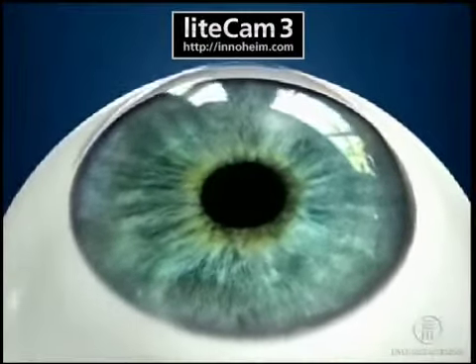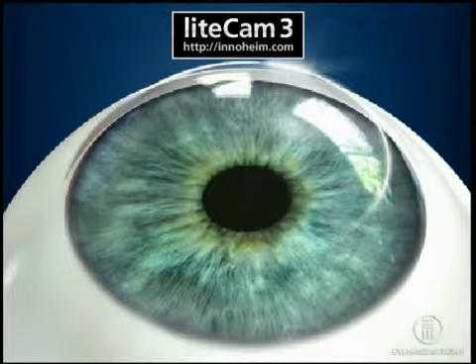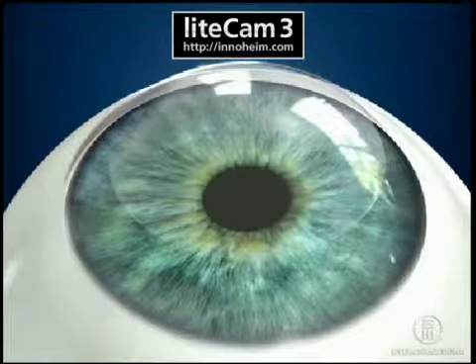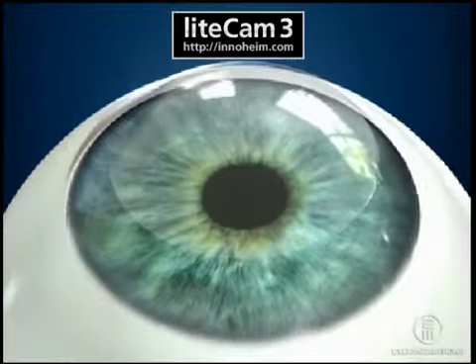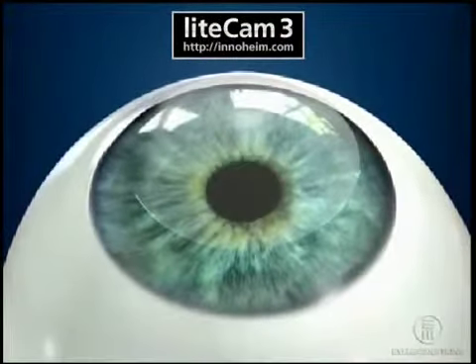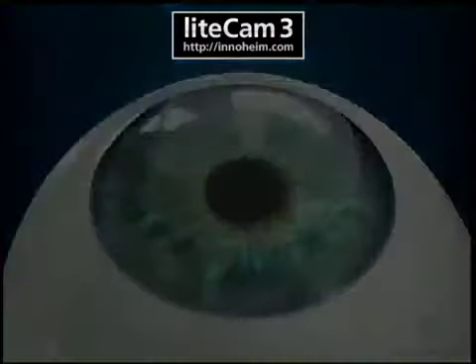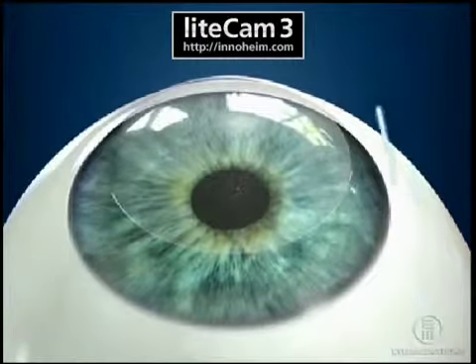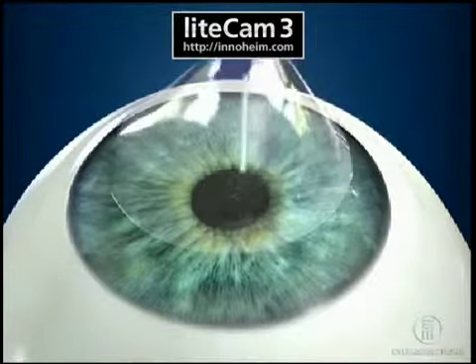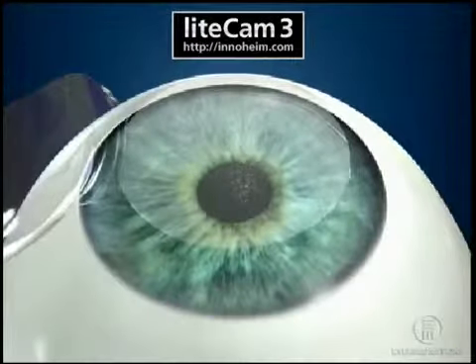For the LASIK procedure, the surgeon will create an incision in the cornea resulting in a flap. This flap will give the surgeon access to the underlying corneal tissue that will be corrected by the laser. Once the corneal flap is made, the surgeon will gently fold the flap back so that the laser beam can gently reshape the cornea.